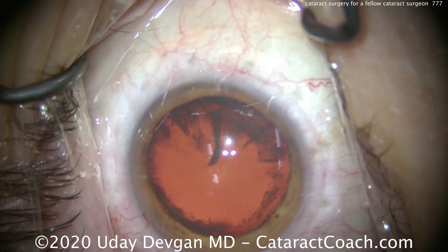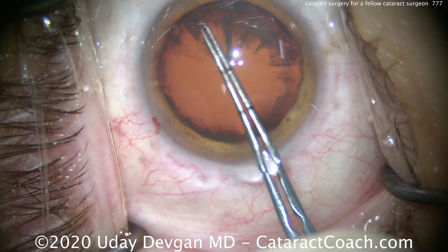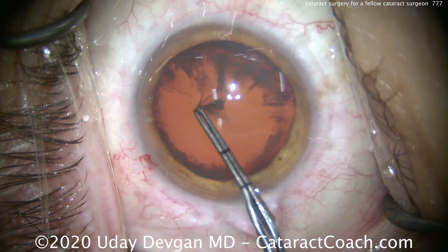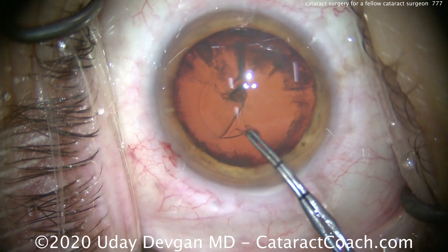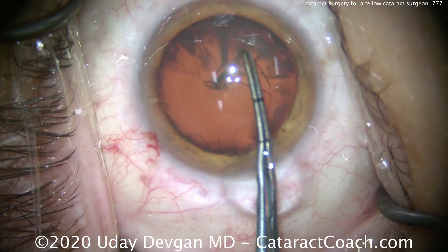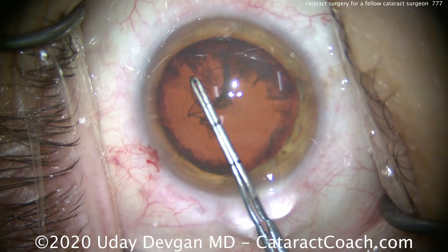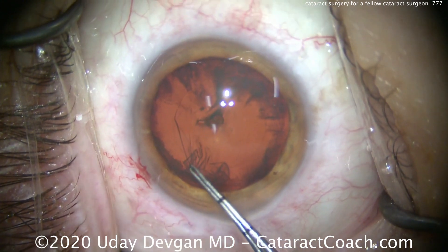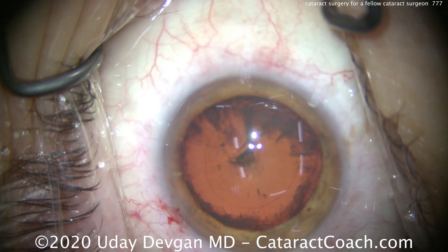The requests from this patient were: number one, a perfect outcome; and a beautiful capsulorhexis. Let's talk about the refractive target — the patient wanted to remain myopic. We're measuring out with the forceps, getting a mental image of where that ideal rhexis would be. We're going to create a beautiful 5mm round capsulorhexis, nicely centered exactly on the visual axis using the Purkinje light images. We want a beautiful overlap of the optic by that capsulorhexis. Measuring it — exactly 5mm.